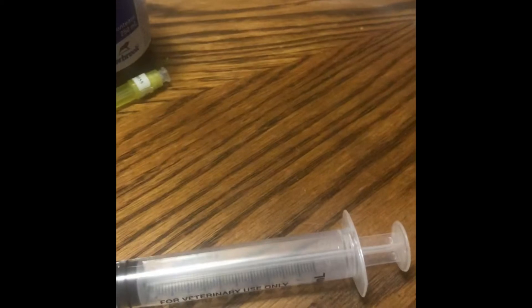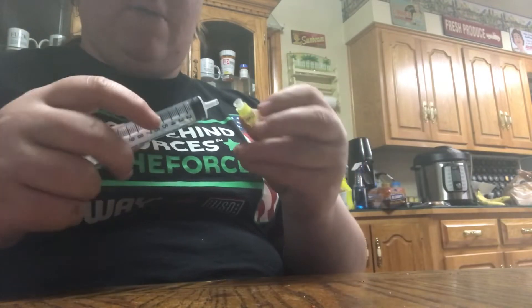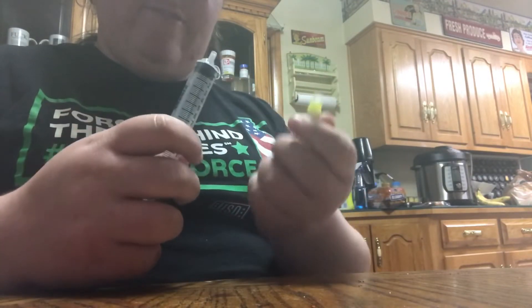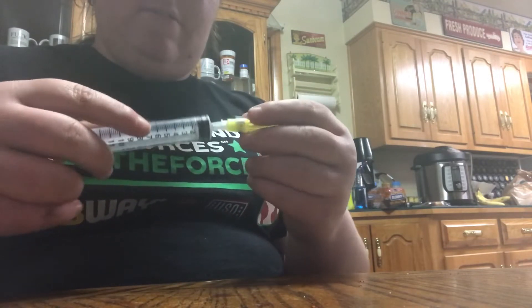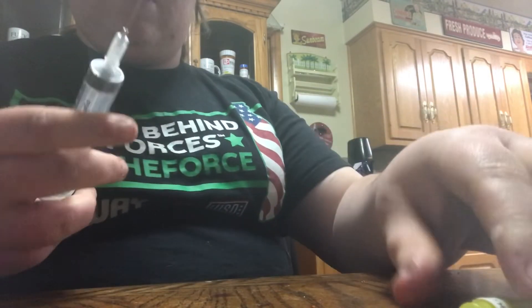I'm going to flip my camera around. We are doing this inside my house at the moment. I'm going to take this — my cap is already off my 20 gauge needle, but I have not taken the cap off the part that I connect to my syringe. That's why I don't poke myself. You're going to put that on there and make sure it's secure.